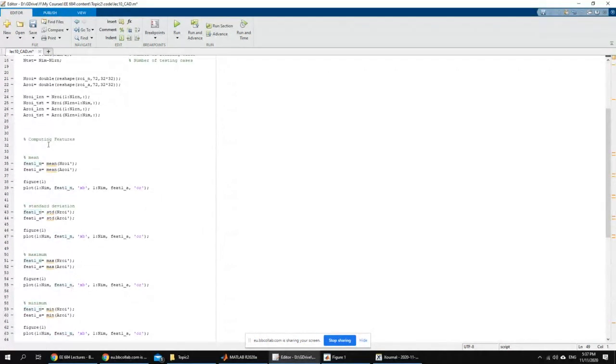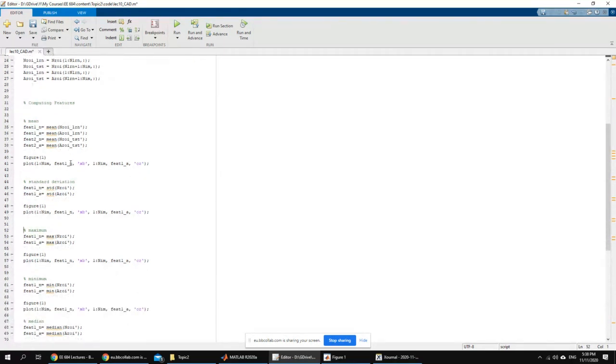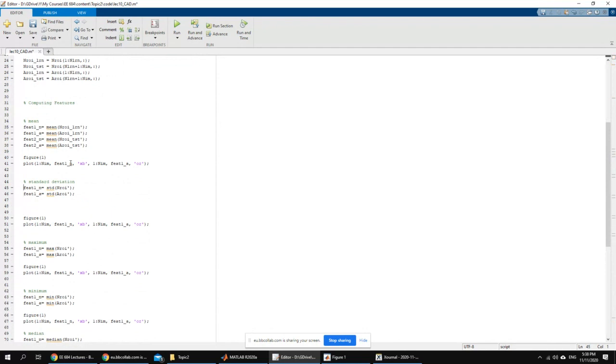Basically, because everything is in ROI, I have to change that into in ROI. If I have learn first, learn, and this is learn. Okay, and I actually have to have another one like this. Let's call it feature 2, n feature 2, and I have to have the testing data here. Okay, I just have to compute the features for each one of them. After I do that, I have to combine all of them. Let's compute these first. Just modify whatever we have here to have all the features, and then see how we're going to combine these features.